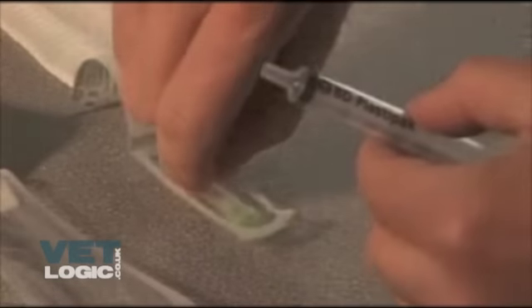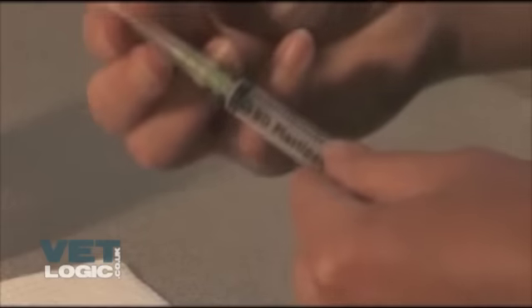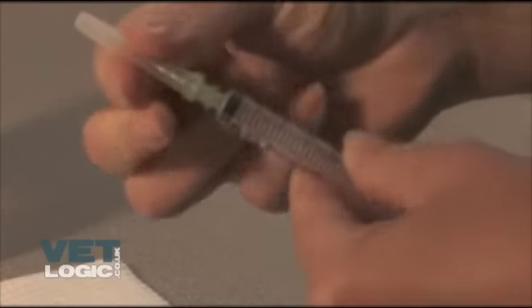Removing the sterile packaging from the needle then attaching the needle to the syringe in a sterile manner, making sure not to touch the ends of the needle and syringe.